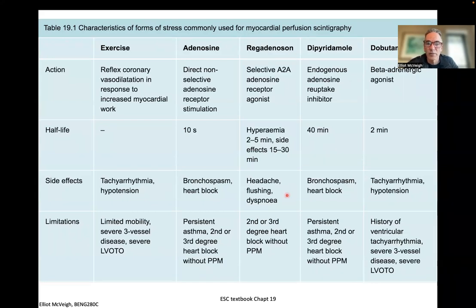I would say regadenoson is the one that's done mostly now in SPECT, right? So you can take a rest and you give the patient the drug and take a stress. And often now what's done is you do the stress first, and then you wait, say, 20 minutes and do the rest, follow up. And we'll see why in a few cases. And that is that if you have a deficit that is fixed, so it happens with stress and then it takes a long time to go away with rest, that's called a fixed deficit, and that's indicative of worse disease state.